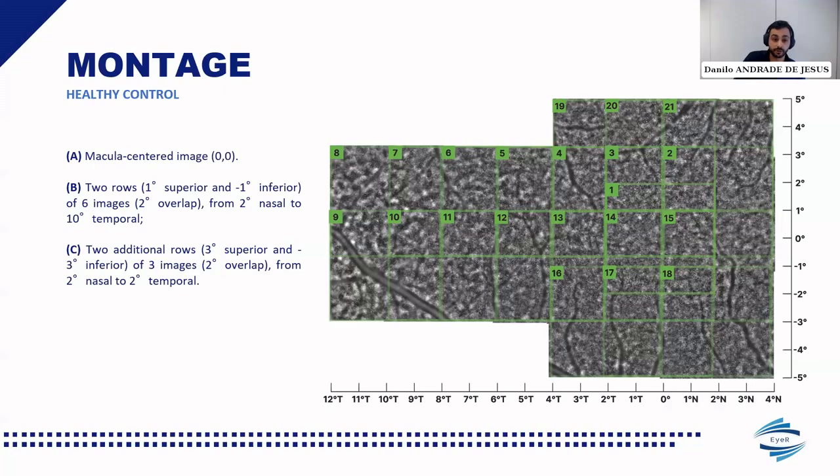Among those, and from the experience we had over the last weeks, I would like to highlight 3. One of them is speed. There is a significant improvement in terms of speed in a protocol like ours, where more images are needed. This means that less acquisition time will be needed for acquiring all of these images, which is preferable for the patient and also for the clinical workflow.